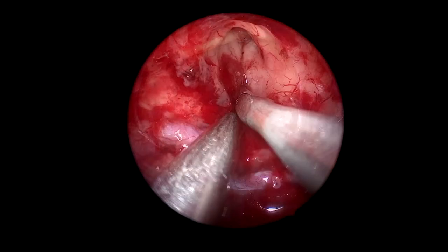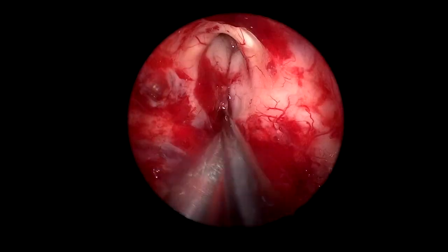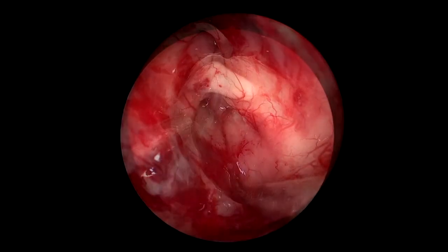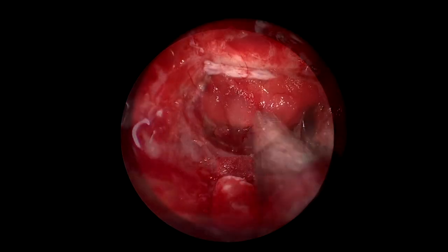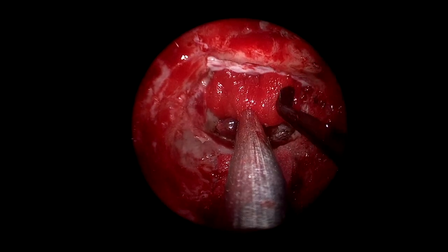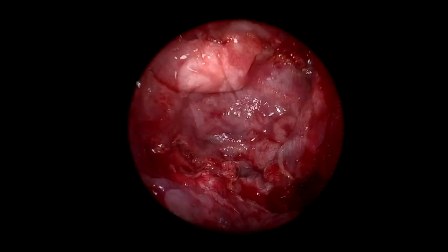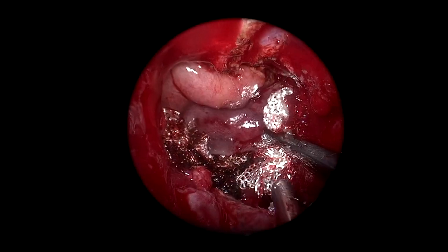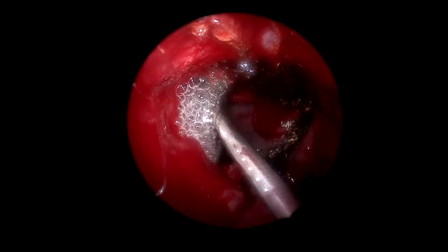The hypothalamus is visualized on both sides. The thalamus is seen superiorly. We can see the massa intermedia and the anterior commissure superiorly with the angled endoscope. Finally, the reconstruction: collagen inlay, fascia lata graft onlay, and then the septal flap covering the whole skull base defect, reinforced with surgicel and fibrin glue.